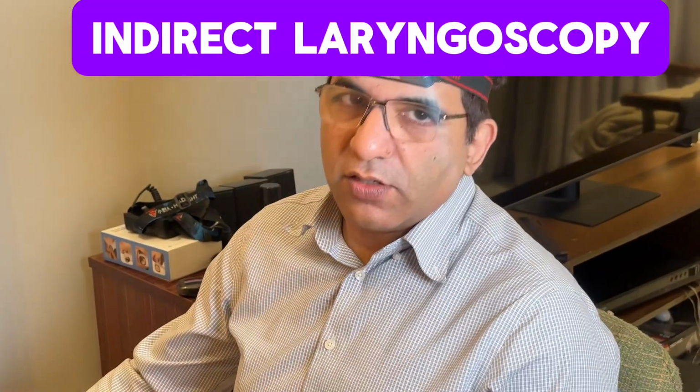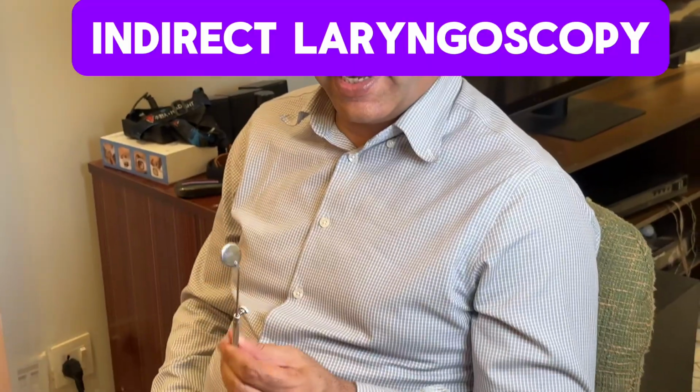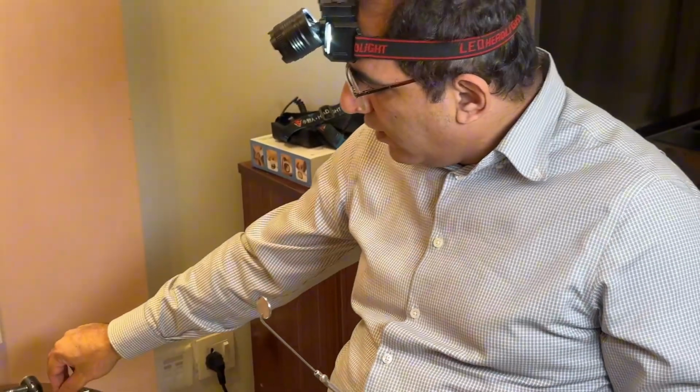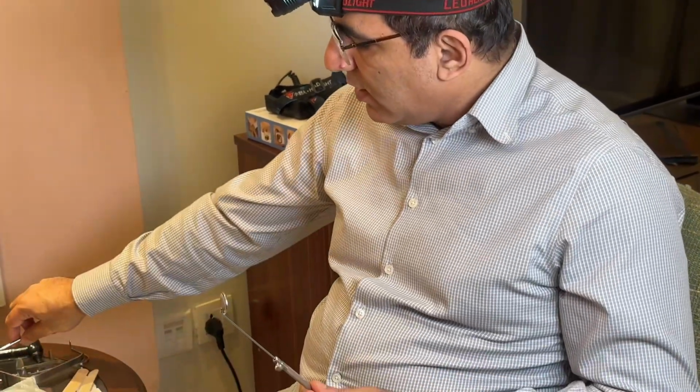Now the next examination step is indirect laryngoscopy. For indirect laryngoscopy, we need an indirect laryngoscopy mirror. So this is an indirect laryngoscopy mirror or the straight mirror. The other mirror is the posterior rhinoscopy mirror, which is a step up mirror. This is used for posterior rhinoscopy, which is a part of nasal examination. And this is indirect laryngoscopy, which is part of laryngeal examination, throat examination, or neck examination.